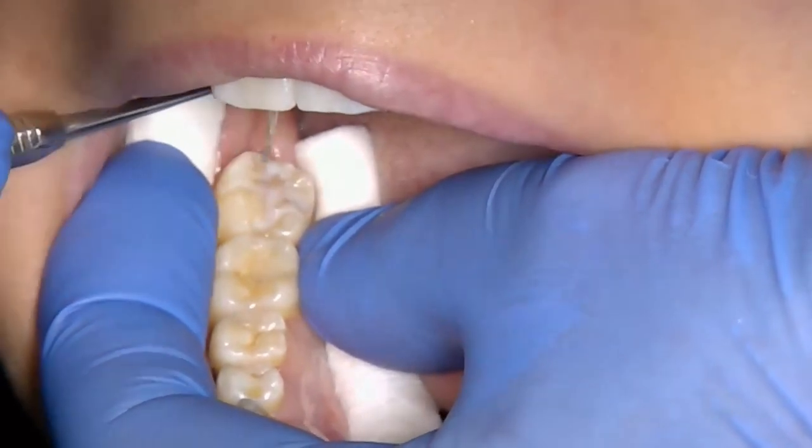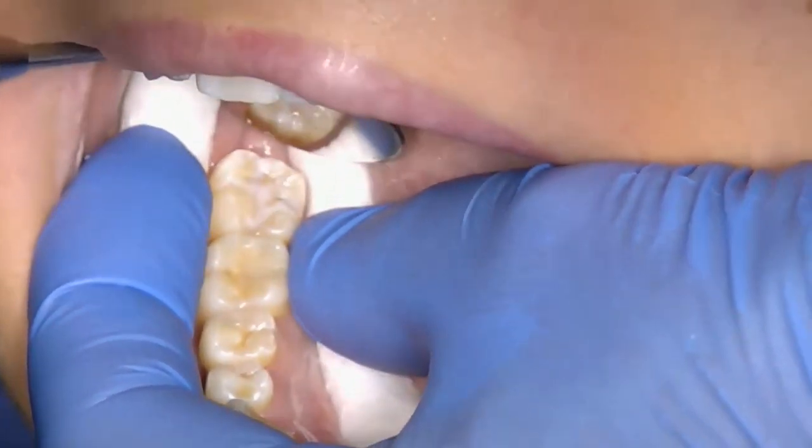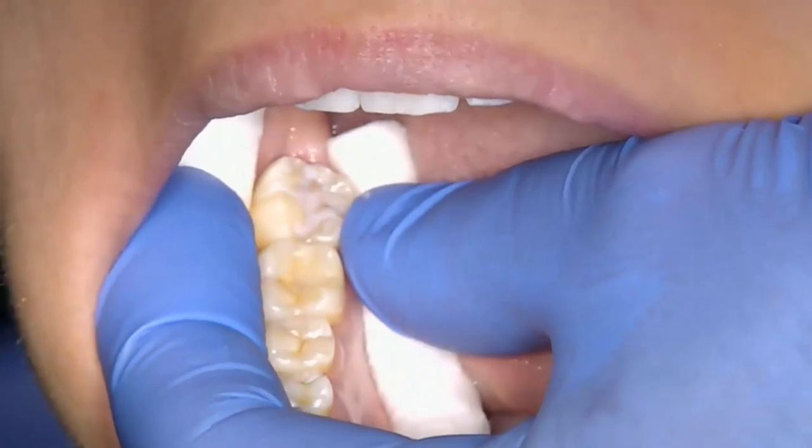Check that the resin has filled the fissures, there are no air bubbles, and there is no excess leaking onto the adjacent teeth. If there are any air bubbles, these can be gently popped with a probe, and if the tooth is overfilled, use a dry micro brush to carefully remove the excess resin.